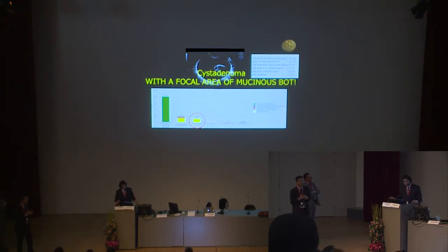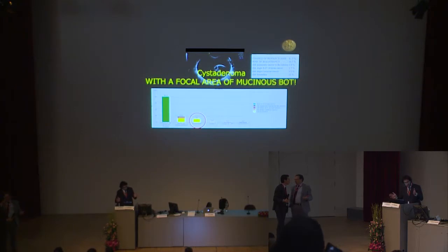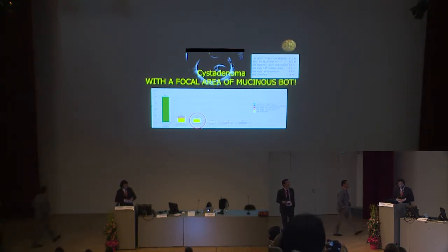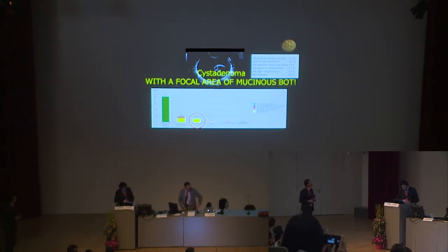It would be interesting to know what Gianfranco would say about this. In a case of a big cystic mass like this, my pathologist usually asks me if I see even one papillary projection or a solid portion, because she struggles to find that and analyze it without making 100 samples of the normal wall of the cyst.